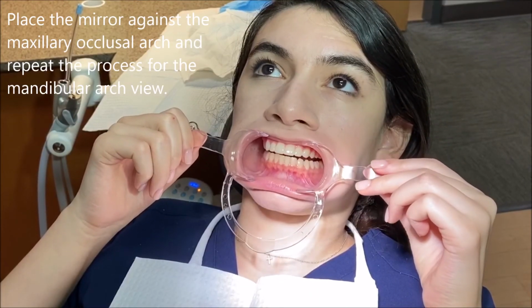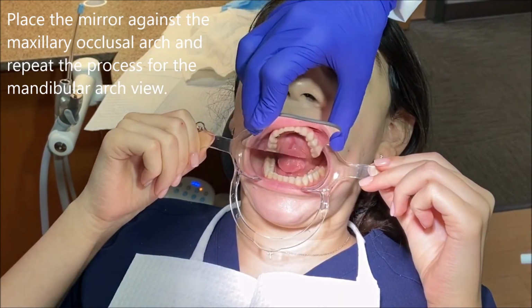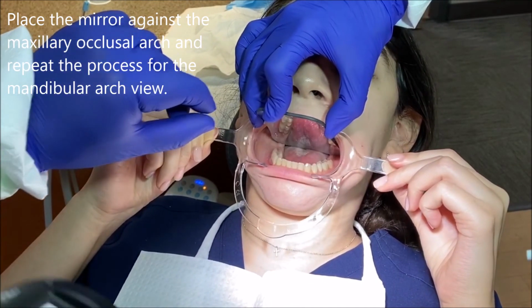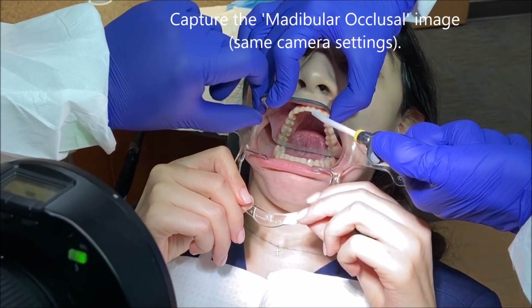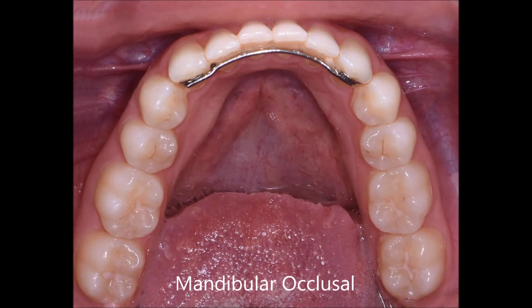Place the mirror against the maxillary occlusal arch and repeat the process for the mandibular arch view. Capture the mandibular occlusal image, same camera settings. Mandibular occlusal.